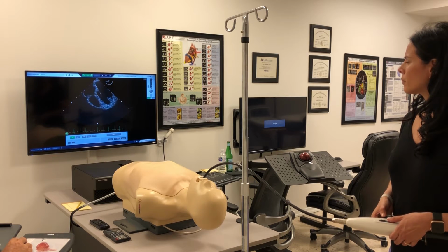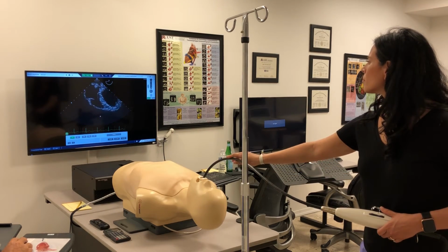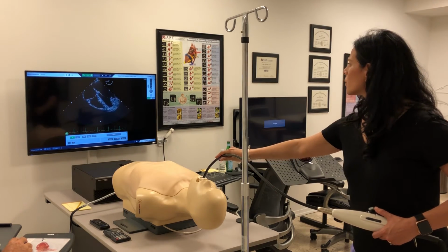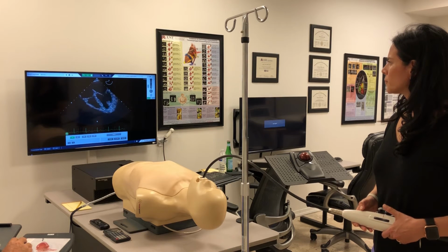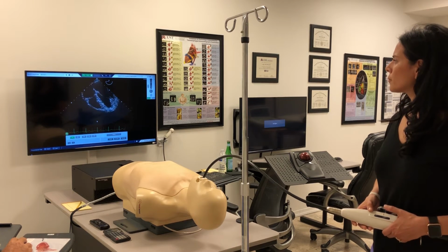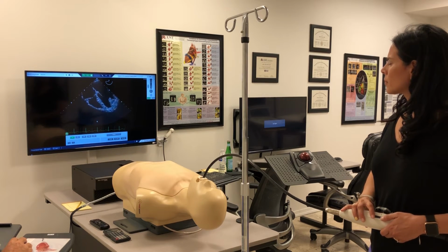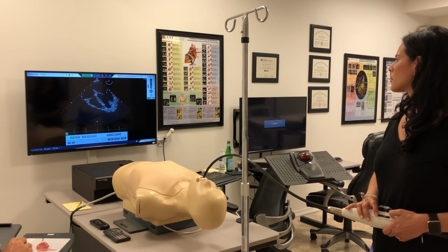So you'll use insertion and withdrawal of the probe to find that nice thin fossa ovalis. So just experiment with insertion and withdrawal. There's a nice thin fossa ovalis, which is what we're really going to look for in the next view. Now, to develop the bicaval view, you have to remember to get the omniplane up in the sagittal plane. In other words, the omniplane has to sit in a plane that will recognize the long axis of the inferior and superior vena cava, which is at 90 degrees. It's a sagittal plane.